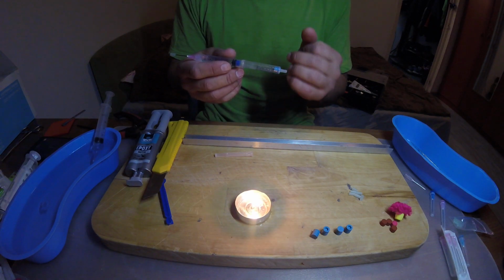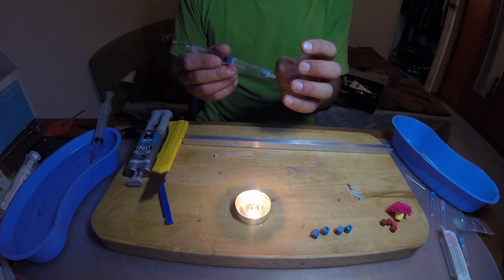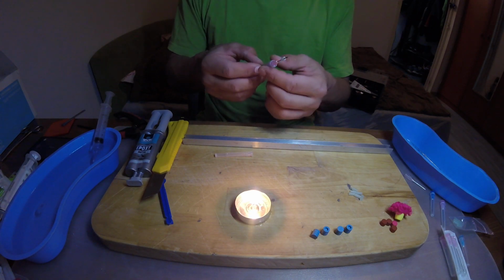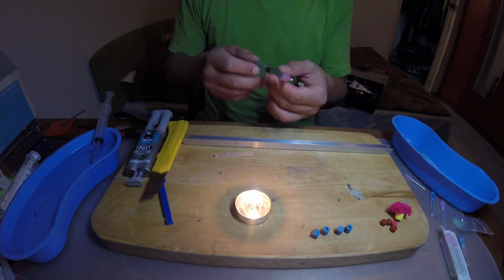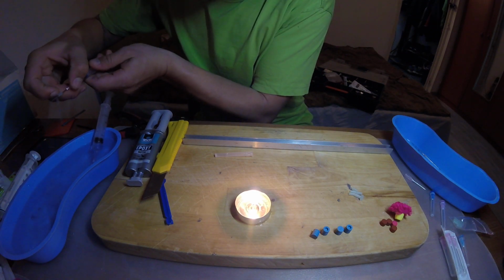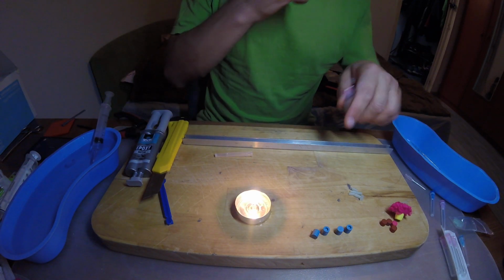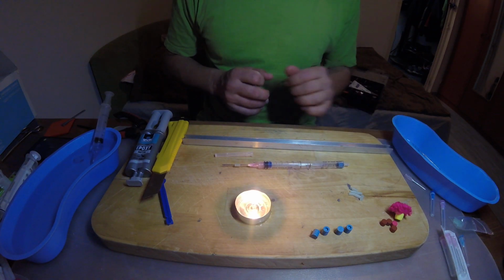We'll have pressure in this chamber. This rubber thingy is gonna block the pressure from getting out the other side, and once you depressurize it, while the sleeve gets back, the substance should get out. Let's see if it works. Okay, it works. Yeah, so this is it. This is your dart, tranquilization dart.